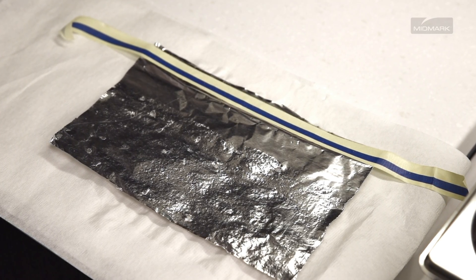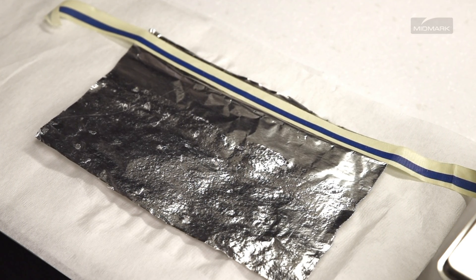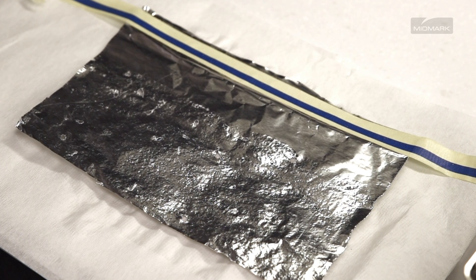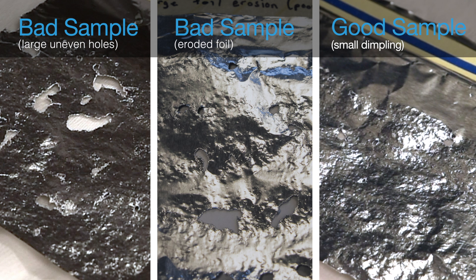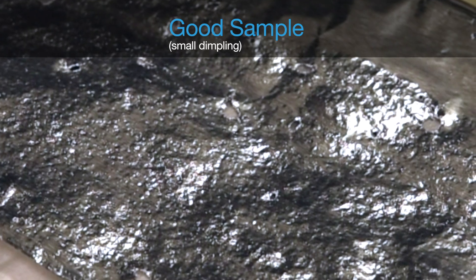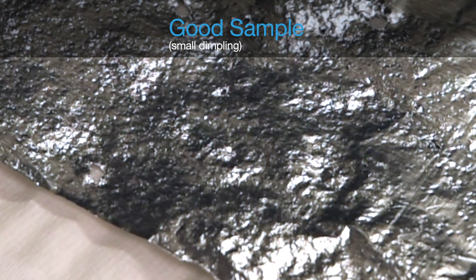The foil surface submerged in the solution should be uniformly covered with a small dimpling or pebbling effect over the entire surface. There may also be some holes in the foil as a result of erosion caused by the interaction between the cleaning solution, the foil, and the ultrasonic action. But the objective of this test is to see how uniform the pebbling is, not how many holes are in the foil. If there are an excessive number of holes in the foil sample, run another test decreasing the exposure time to get a better sampling of the uniformity of the dimpling.